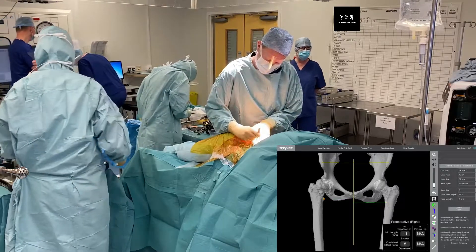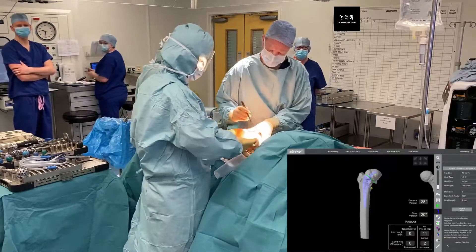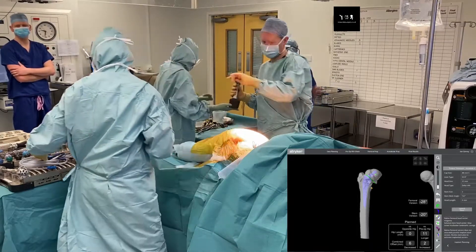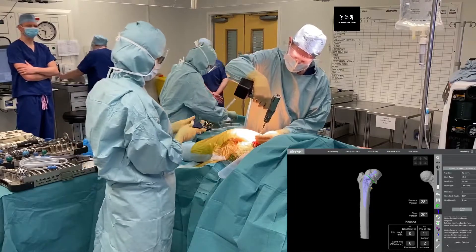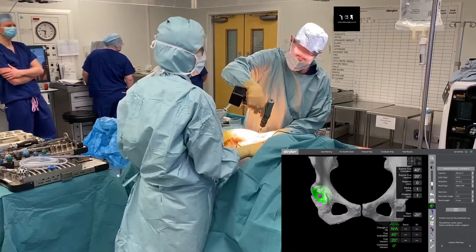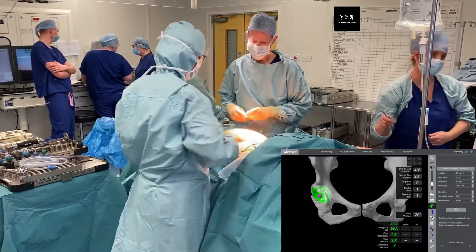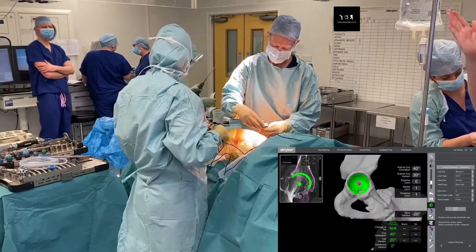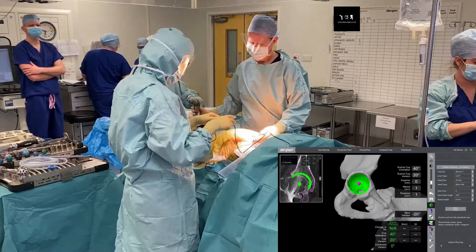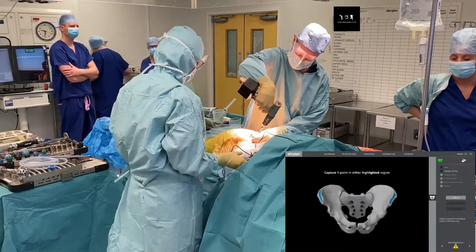I'm going to give you a quick run-through of a Mako total hip replacement. Here we can see the start of the procedure with the patient in the lateral position, and we're going to place three pelvic pins for the tracker placement. I do this freehand using a drill and threaded pins. We place one drill in the iliac crest and then put a tracker base over the top of the first drill pin.